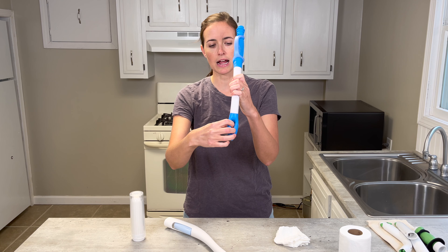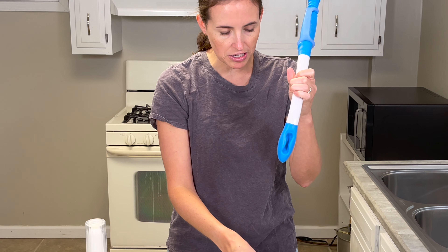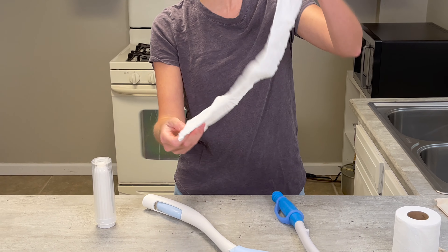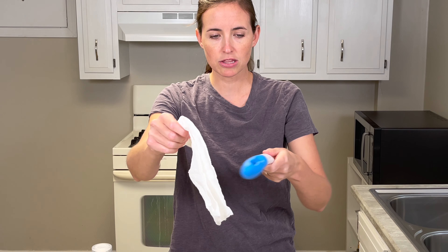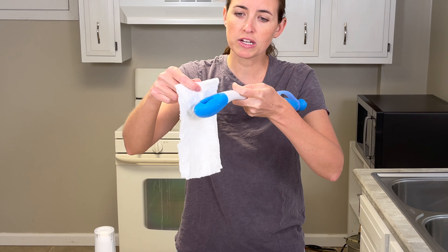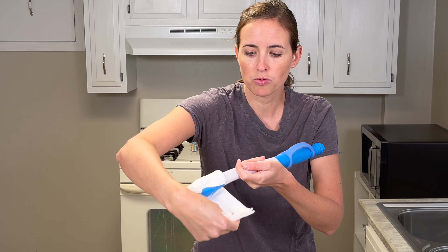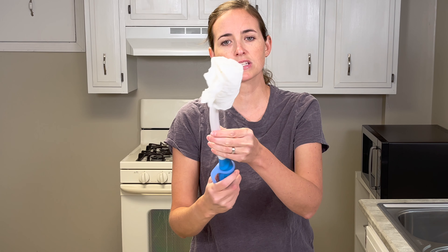It has a little opening on a very sticky silicone end with some little bumps or teeth inside. You'll use a similar amount of toilet paper — around eight squares, folded in half, then in half again, giving you a two-by-two square of good ply. You then insert one end into the opening and just press it in; it stays because of the silicone grip. Then you wrap it around and tuck it back in. Make sure it's in there well — you don't want it flapping open. The end should be fully covered.